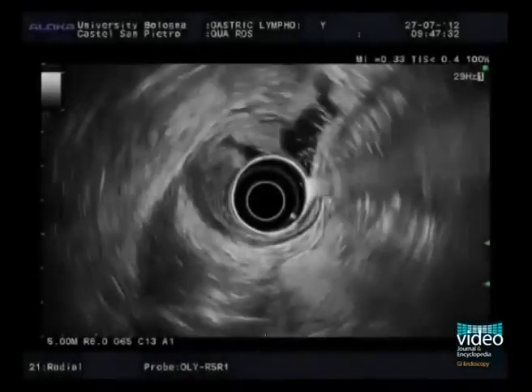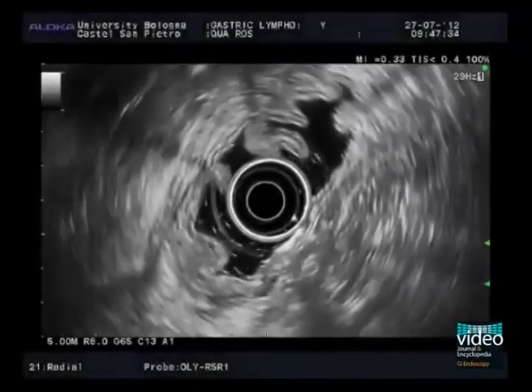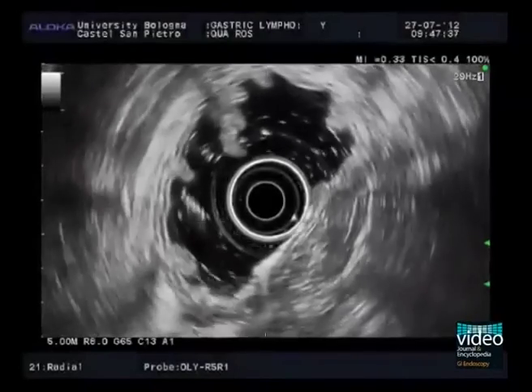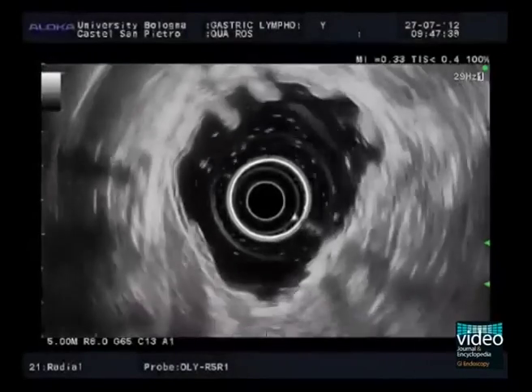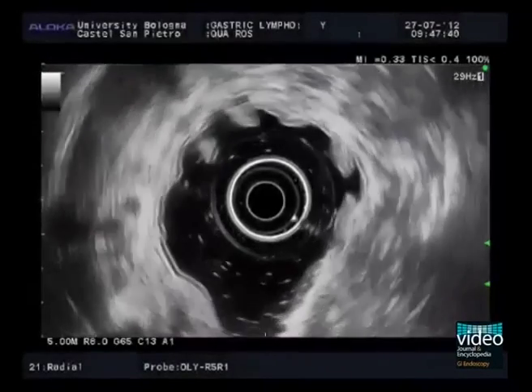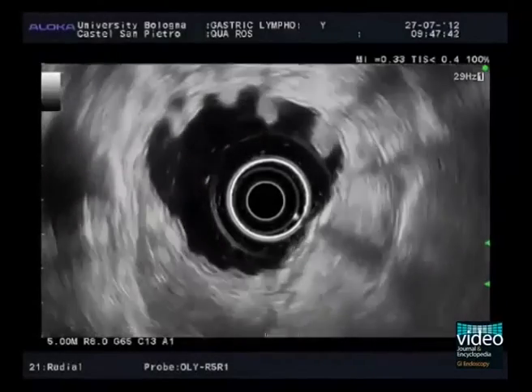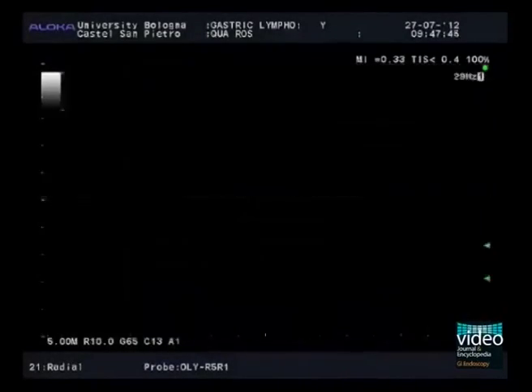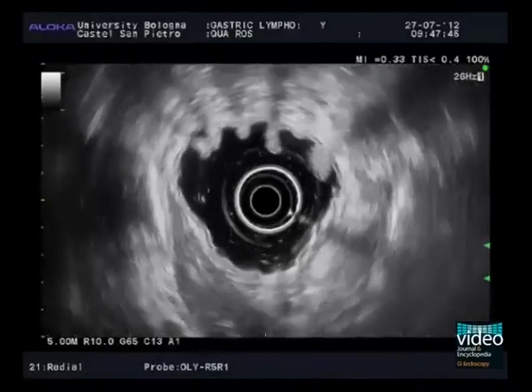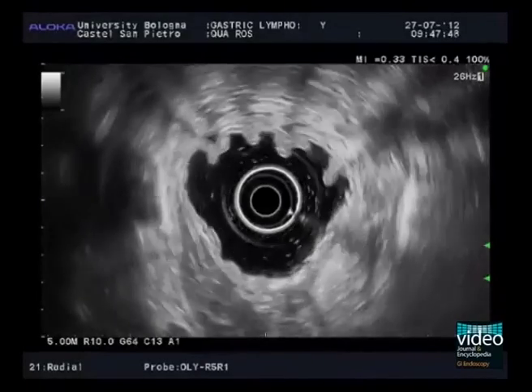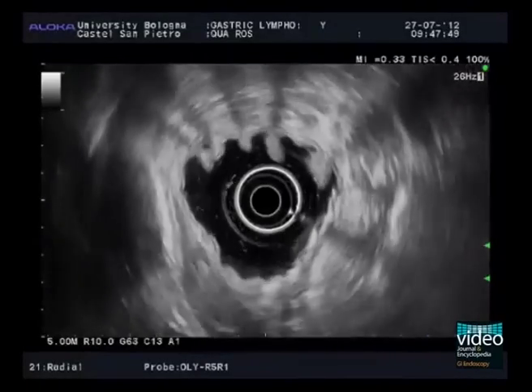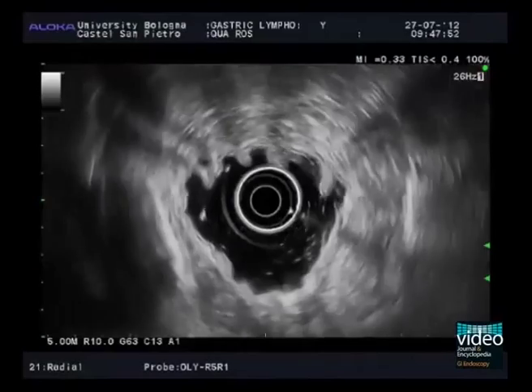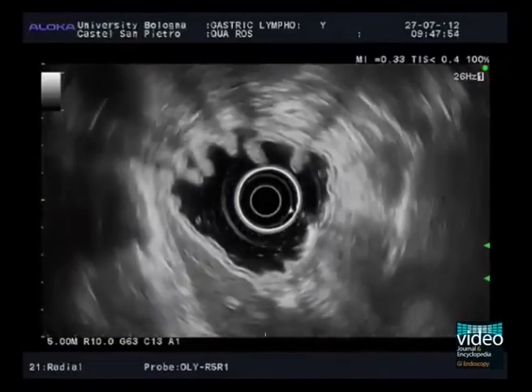The procedure is completed with transgastric scanning. The image is demagnified to allow deeper investigation of the perivisceral structures and organs. In this case, no lymph nodes are visible. Normal left hepatic lobe, spleen, pancreatic parenchyma, and celiac trunk are shown. These findings are compatible with an N0 stage gastric lymphoma.